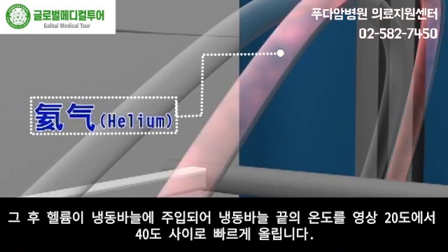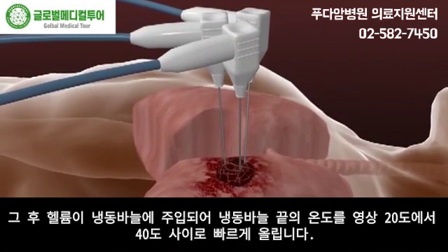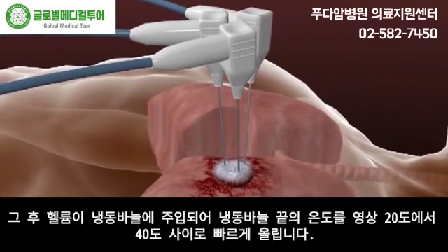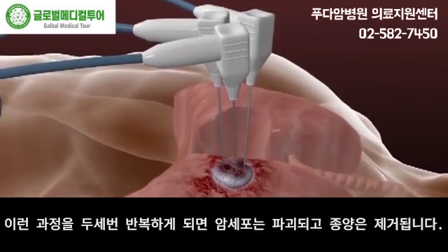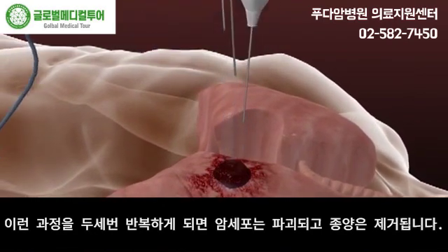Then helium is injected, after which the tips of the cryo needles are precipitately heated up to 20 to 40 degrees centigrade. After two to three cycles, the cancer cells are destroyed and the tumor is fully ablated.